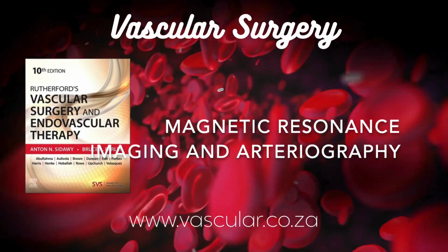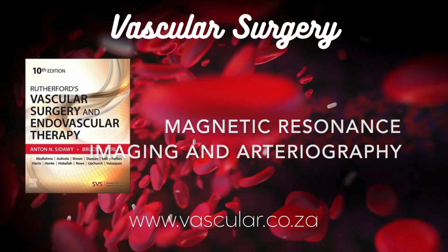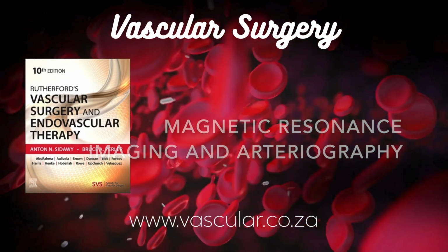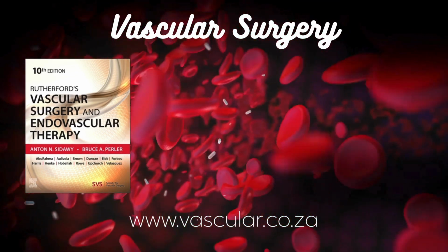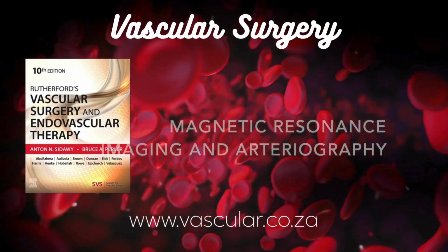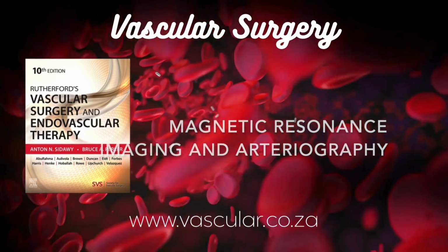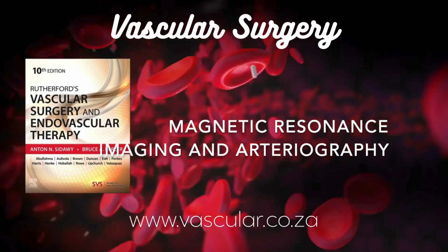Absolutely vital, especially for sicker patients or those needing sedation. You need MR-compatible monitors for ECG, oxygen levels, etc. Interestingly, there are even special MR-compatible blood pressure cuffs. What are they used for? Sometimes, particularly in leg MRA, inflating a cuff on the thigh briefly can slow down the venous return from the lower leg. Ah, reducing that venous contamination again. Exactly.